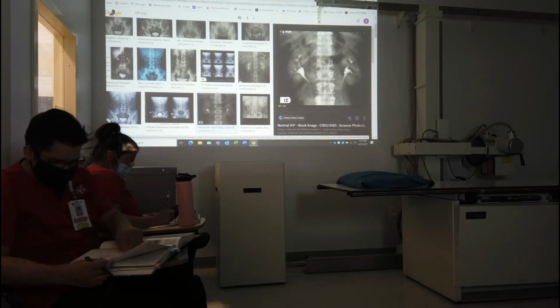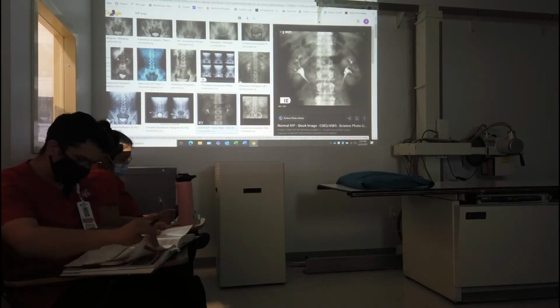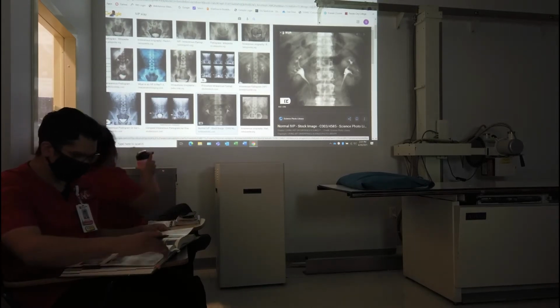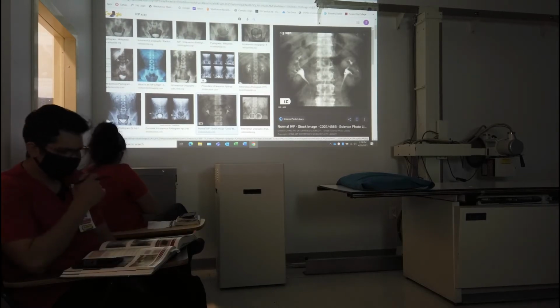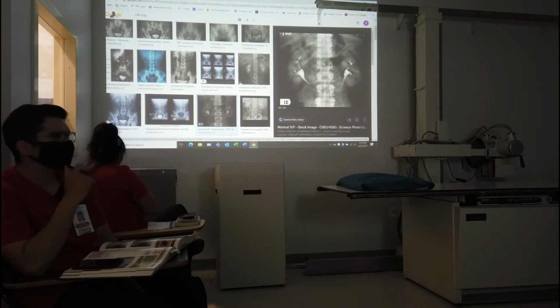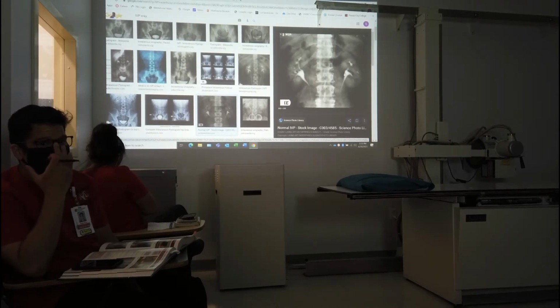So if those kidneys aren't functioning properly, we don't do the test. It's out of range. That test ain't happening. They are not getting an intravenous contrast injection. They do something different, like a CT scan without contrast. Imagine if the kidneys aren't functioning properly and that stuff just stays in there. It's going to cause some serious issues.